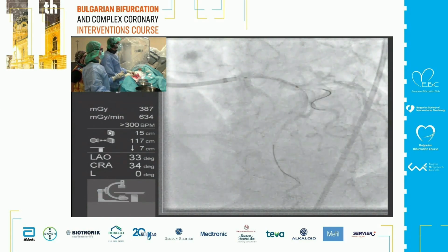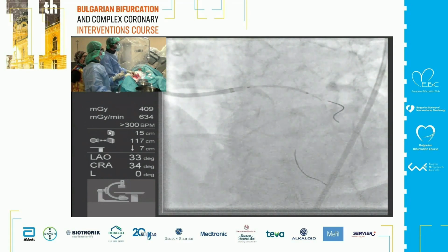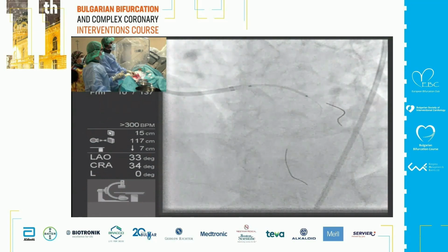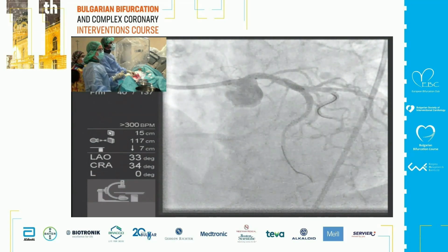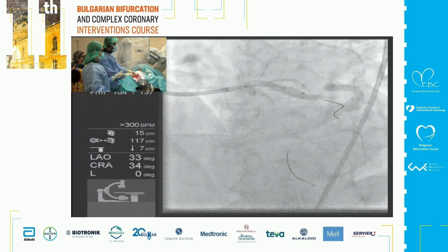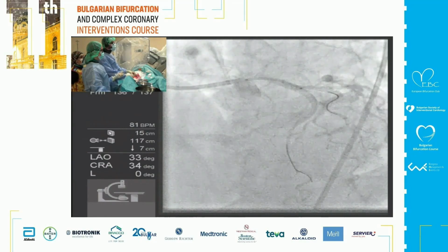A bit back. Yeah, it's good. You have to cover the upper rim. While guiding, you have to pull. What do you think? Do you like the position? No, pull. Here is good. Wait, move. Here is good, and pull the guiding. Okay.